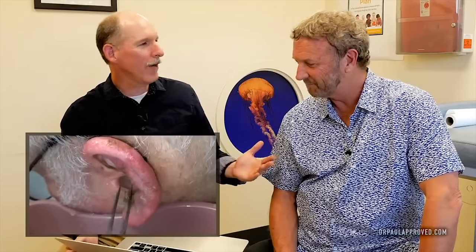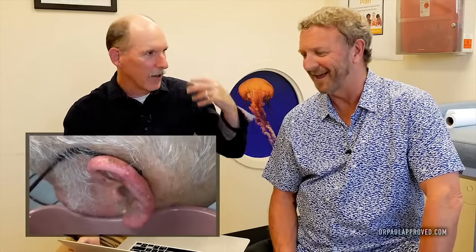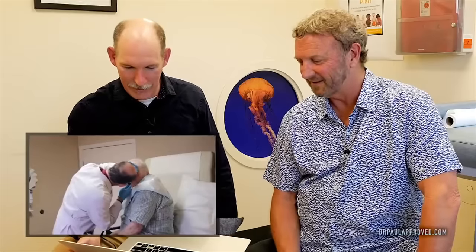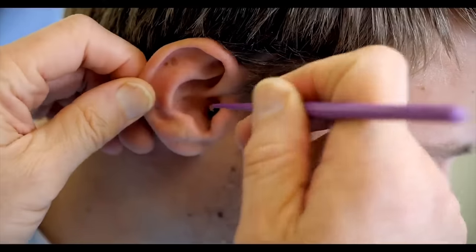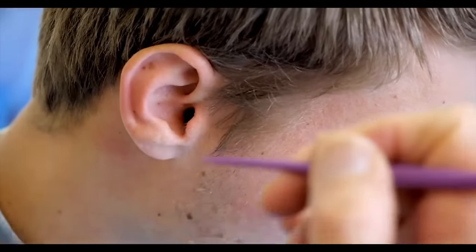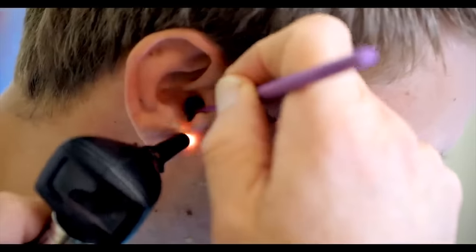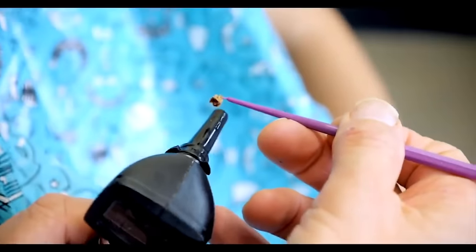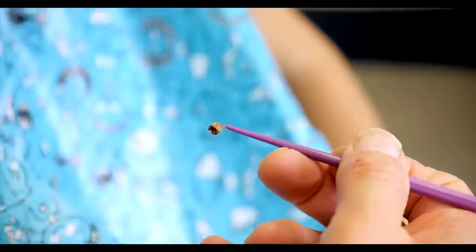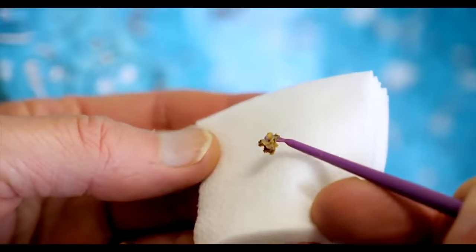My hair touches it. You don't have this with your patients — with the older patients they have all this hair. Sometimes we'll even trim it. The ears are sensitive. Get some light on the subject. There it is. Look what we got. Whoa, that's a nice little chunk. I think it'll look better if we put it on the white for contrast.